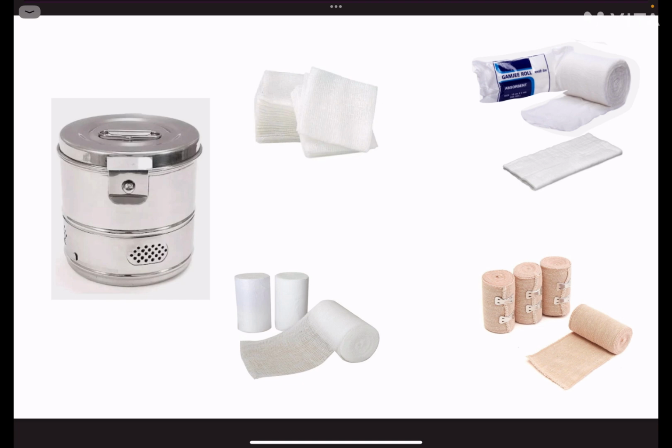The Gamgee pad was invented by Dr. Joseph Samson Gamgee. It is available in form of Gamgee roll or Gamgee pad. It has a high absorbent property. It promotes quick healing of the wound. It is skin friendly.